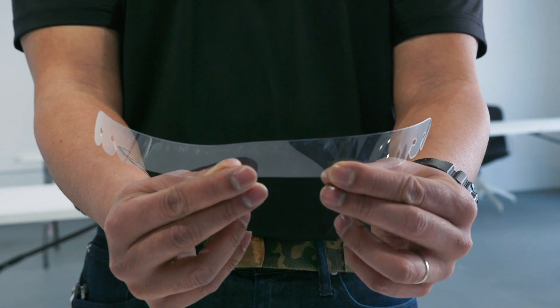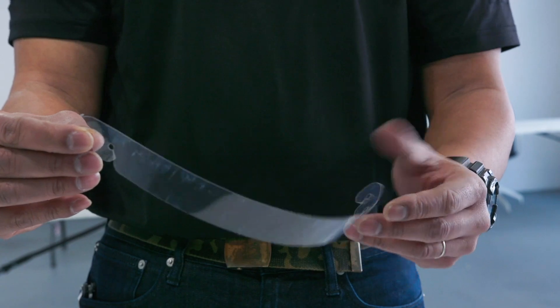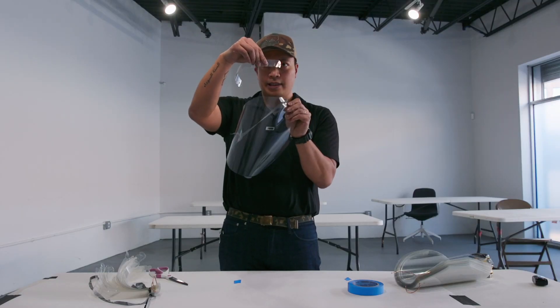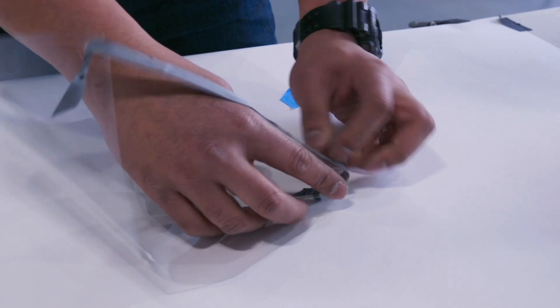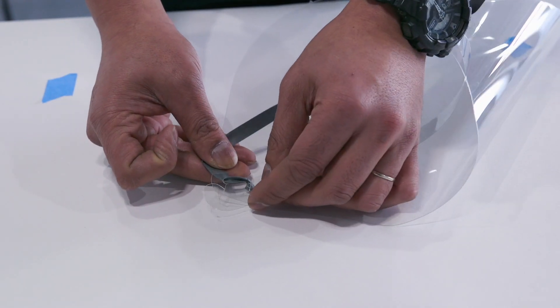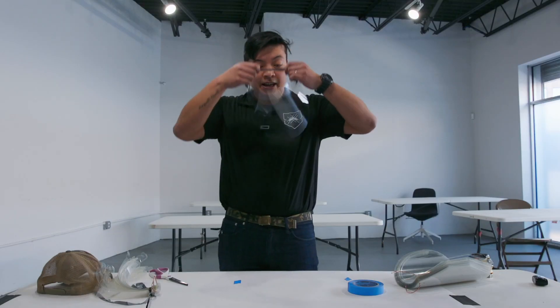Next we're going to take the forehead piece. As you're wearing the shield it's going to go on the inside with the slots downward. You're just going to find the space between the rubber bands and slide this tab through it, and the rubber bands will just clip right into the holes. Just like that — your face shield is made.